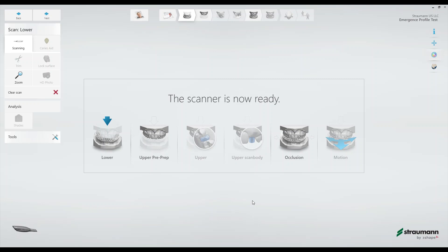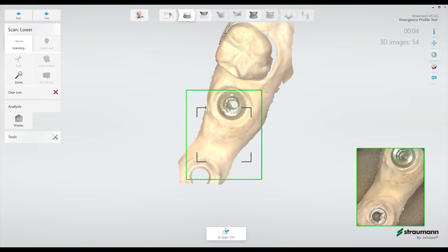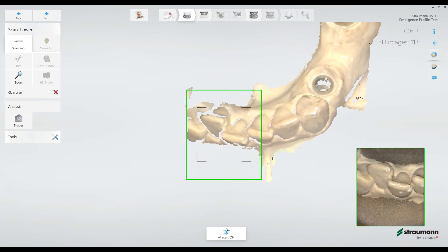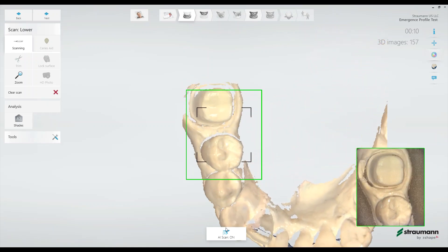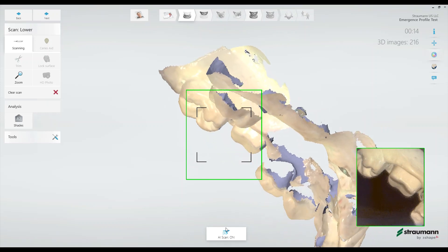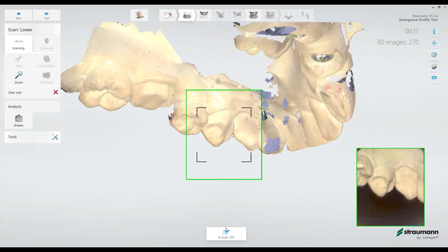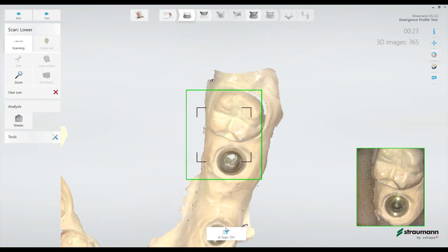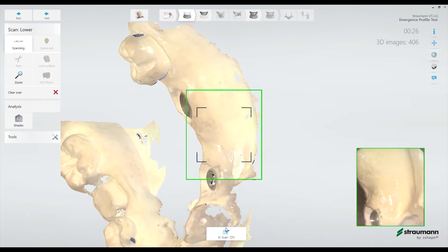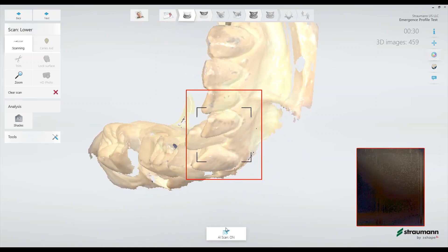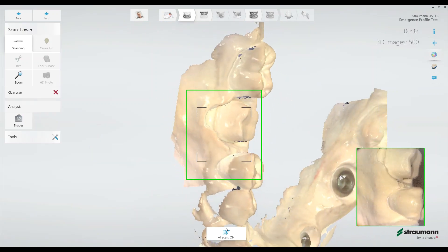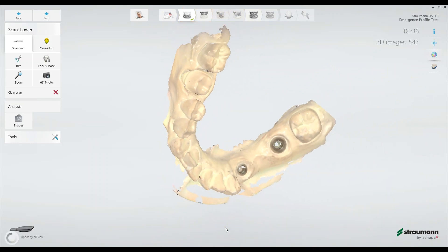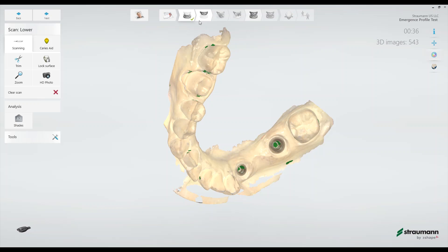As I mentioned before to minimize the clinician's time in the pre-operative scanning, these scans can be taken by the dental assistant. Next I'll scan the upper with the healing cap in.